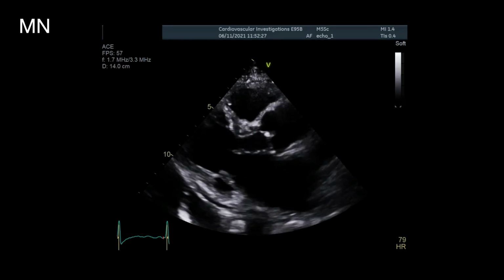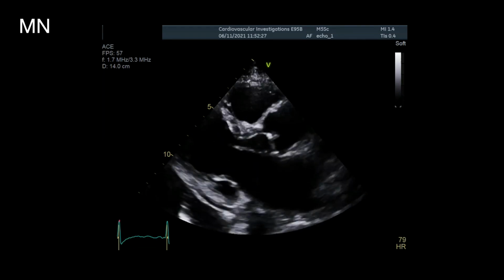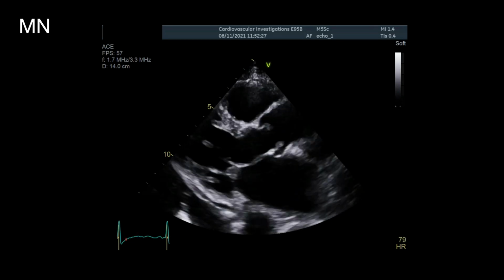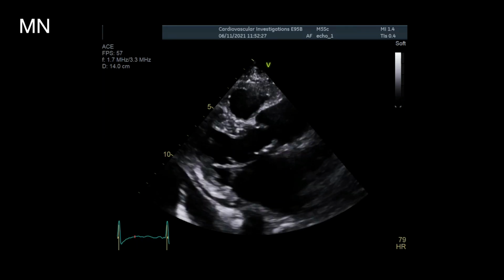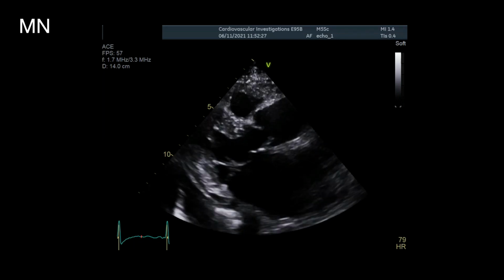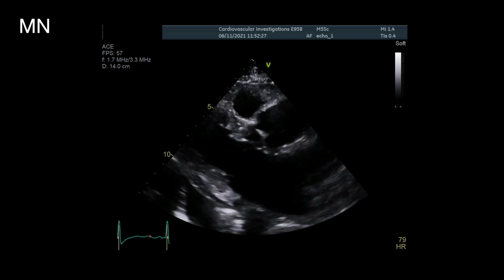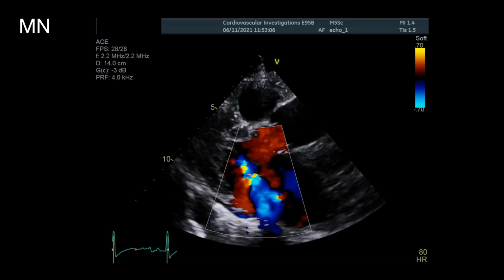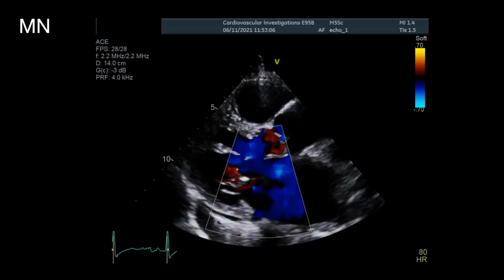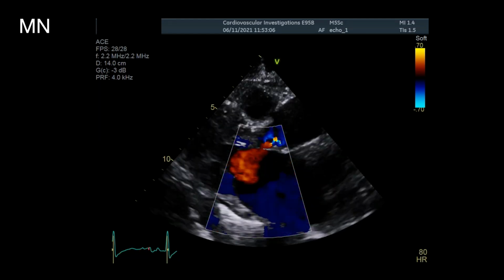And zoomed in, again you can see the right ventricle at the top of the screen, it's difficult to make much comment about that now. And you can see the aortic valve opening and closing, the mitral valve opening and closing. In this window, a reasonably vigorous LV and the impression of LA dilatation and that small pericardial effusion at the bottom there. Some colour has been put over the mitral and aortic valves, and you can see some mitral regurgitation there.